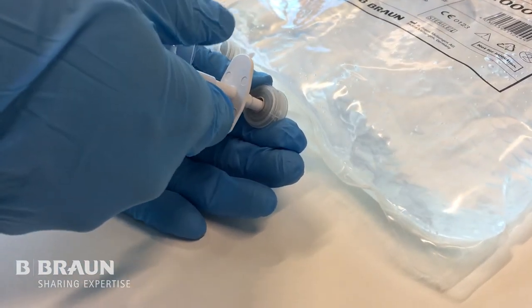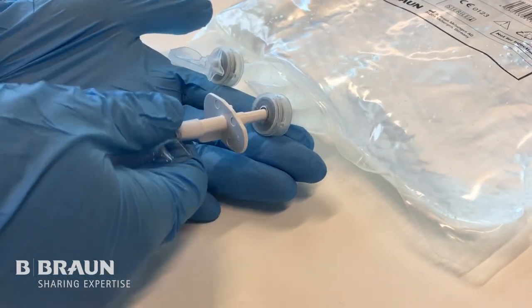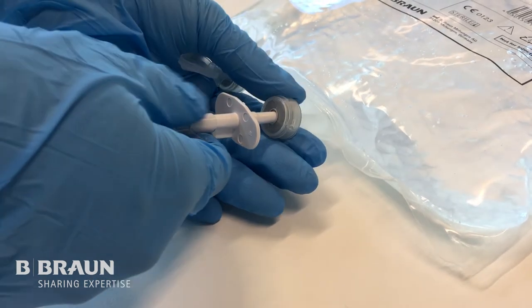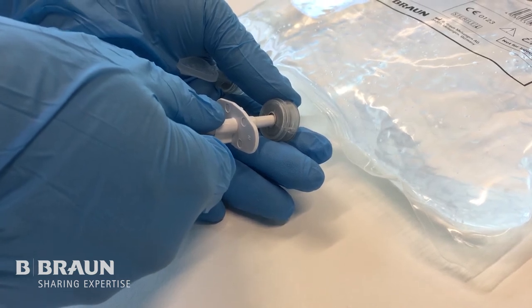Now stop pushing the spike and let the elastomer come back into its original position so that the port will reseal. Finally, introduce the spike completely into the port in one straight motion.